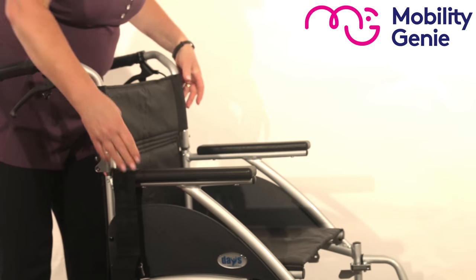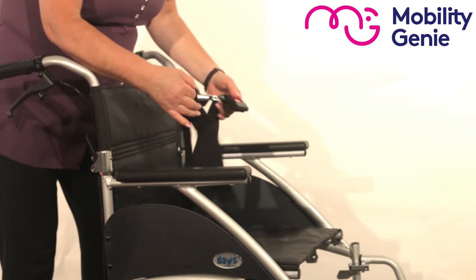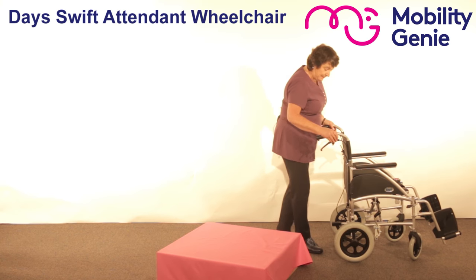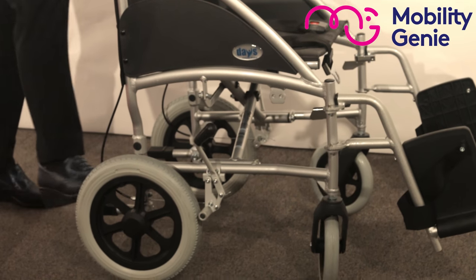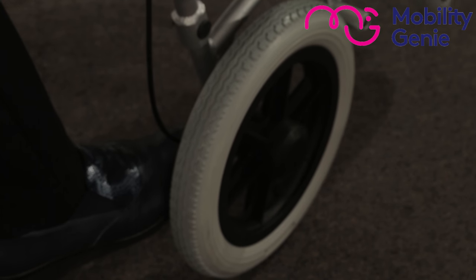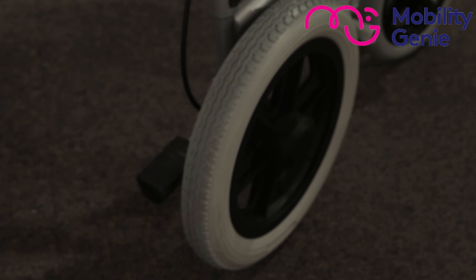With this wheelchair, because it's an attendant wheelchair, you've got a seat belt. It helps the person feel safer. And then at the bottom you've got two little grips, which assist the carer when getting on and off a footpath — by putting their weight on it, it allows the front wheels to go up onto the footpath.